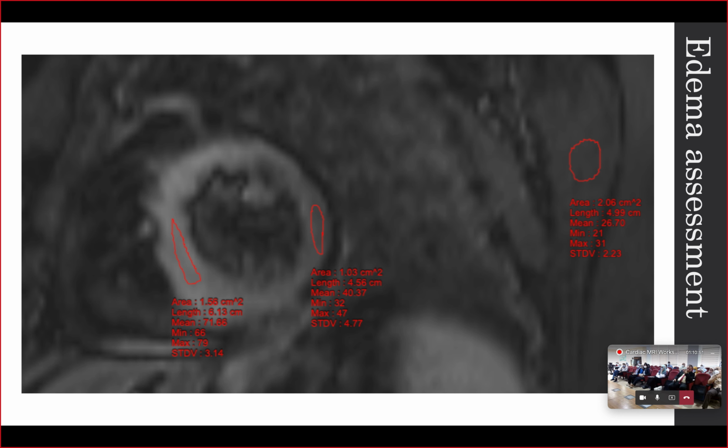At the beginning it was very subjective to see the edema, the high signals in the affected territory. Later on it was compared to the skeletal muscle, but now many vendors put the coils underneath the patients, which gives a lot of artifacts.